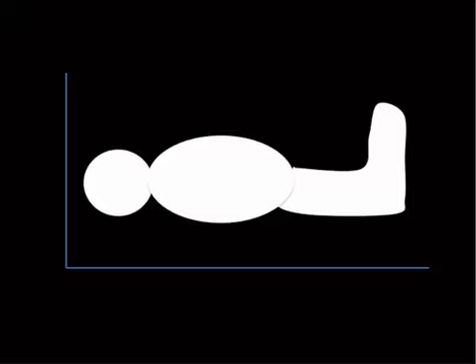So a steep gradient slope results in a large difference in precession frequency between 2 given points on the gradient, while a shallow gradient is going to result in a small difference in frequency between the same 2 points. On a certain gradient slope applied, the RF pulse transmitted to excite the slice must contain a range of frequencies that match the difference in precession frequency between those 2 points. That frequency range is called the bandwidth.